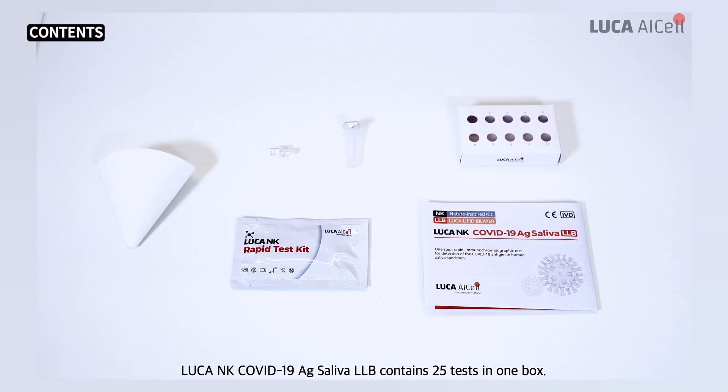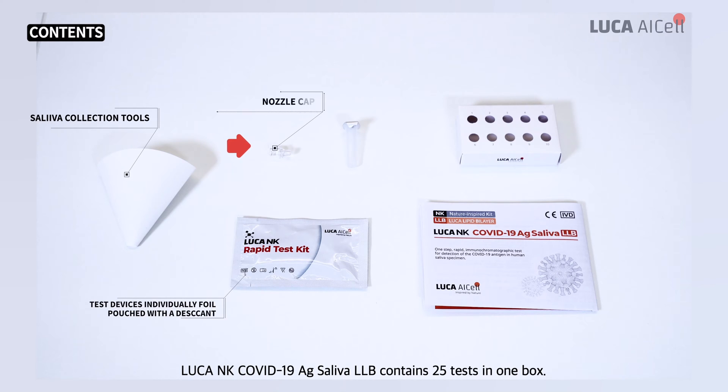Luca NK COVID-19 AG Saliva LLB contains 25 tests in one box. The contents of each product are as follows.